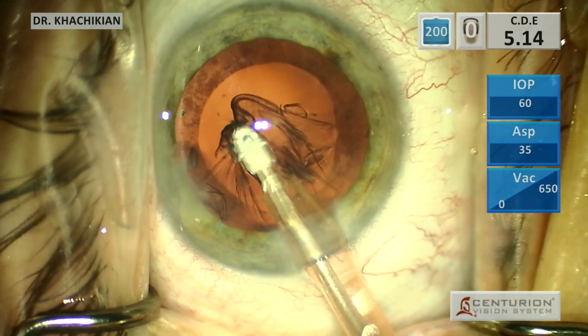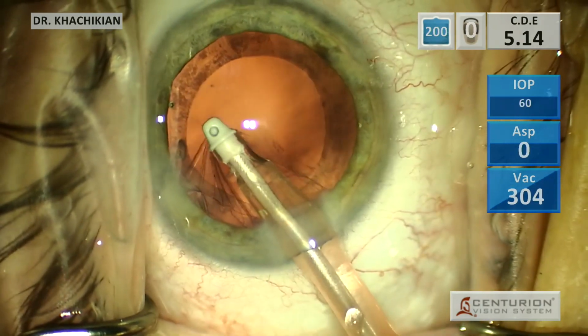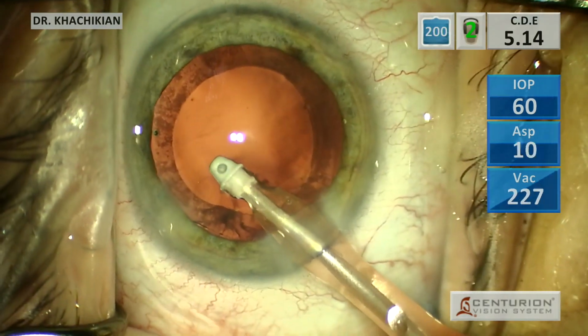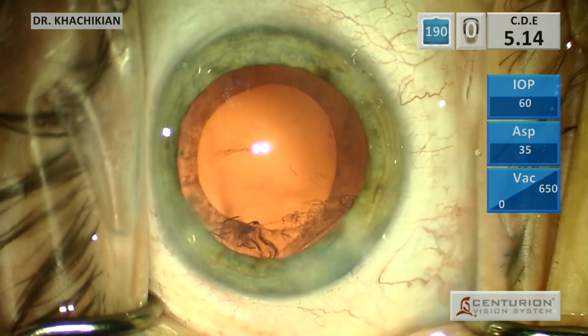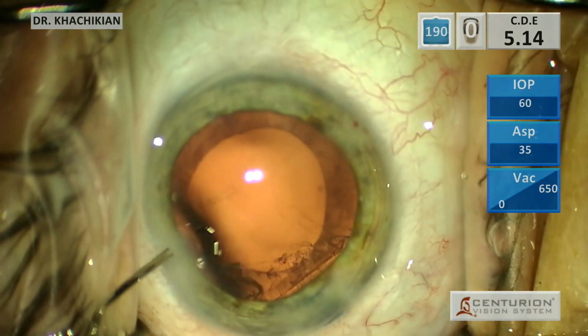Now, I tried not to pull too much. It's almost counterintuitive, like why wouldn't this last bit of cortex come out? It's just because the zonules are so loose in that area. So we're not going to push it because we got the big sheets of cortex out. It's just a little bit of wispy remains, and we're going to leave those, but you can see the bag in two places has lost some of those posterior zonules.